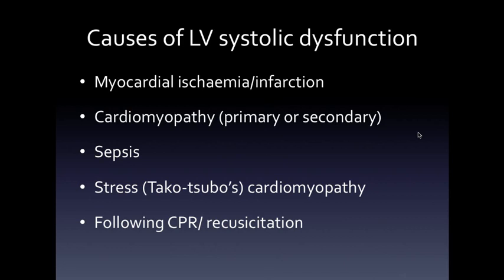Sepsis is a very common cause of significant and, hopefully, transient left ventricular dysfunction in the acutely ill patient, and is often missed because the patient comes in under, for example, the surgeons with a hot gallbladder, gets septic as be damned, is managed in a surgical manner, then somebody says, well, they're not doing well, and the ECG doesn't look too different, but you put the echo probe on them, and lo and behold, the LV function is down because they've got sepsis running through, and that's where the intensivists get involved and save the day, I hope.